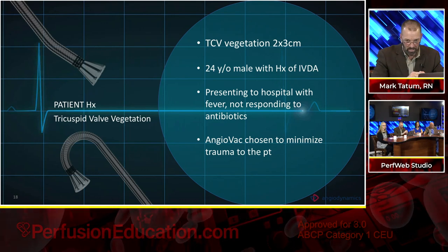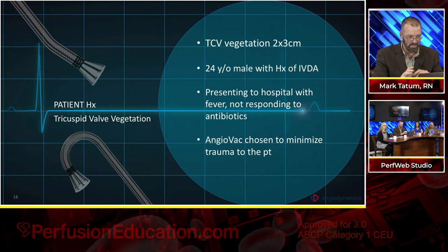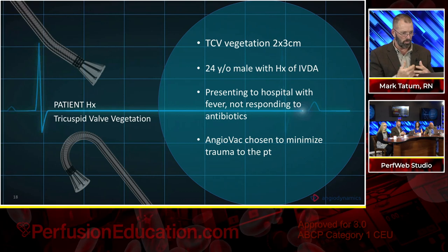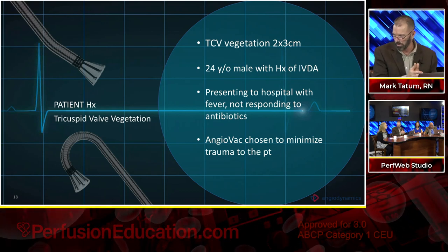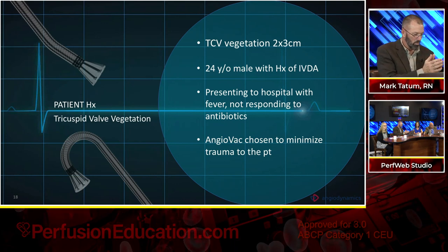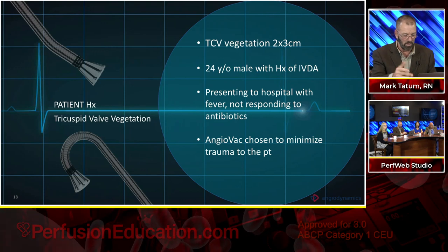We got it, yes. History of IVDA, presence, not responding to antibiotics with fever. Again, clinical presentation trumps all. Just like you guys and all of us were taught, you don't just treat the monitor, you treat the patient. We take not only what we see on an image, but what their clinical presentation is and how they're progressing into consideration. So let's go to the next slide.